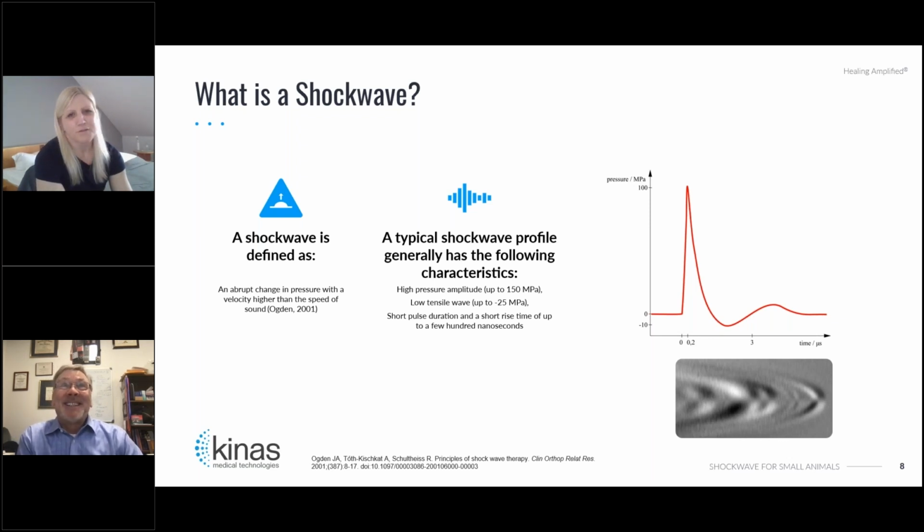Yeah, I think it's different because where the Shockwave comes from, since it's from kidney stone removal or getting rid of the kidney stone without injuring the kidney, that's a different approach. And using it in orthopedic or neurologic cases, we want to promote moving more easily, so it wouldn't be beneficial to just shockwave it and then just let it run.